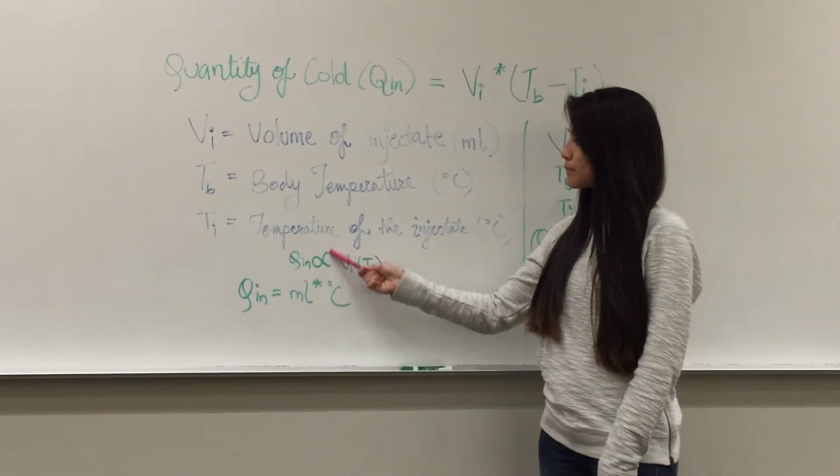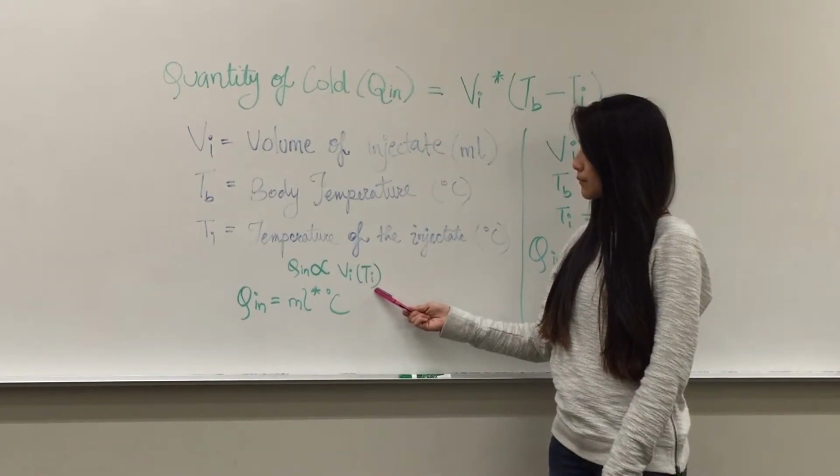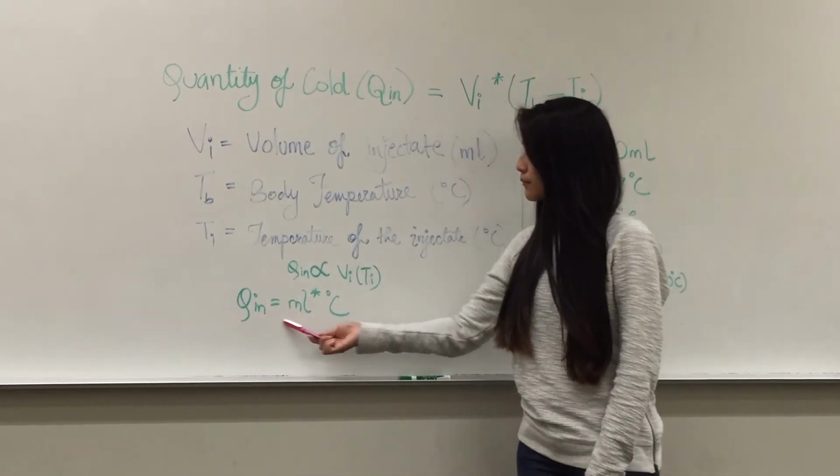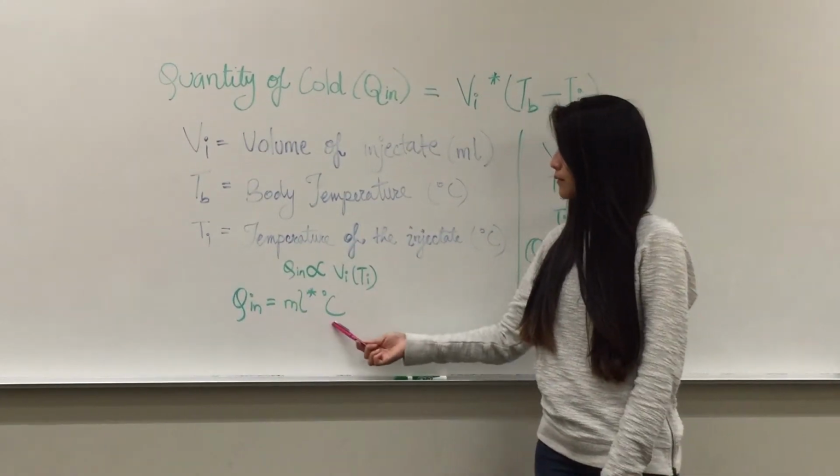Qin is jointly proportional to volume and temperature of the injectate. The unit of Qin is milliliters times degrees Celsius.